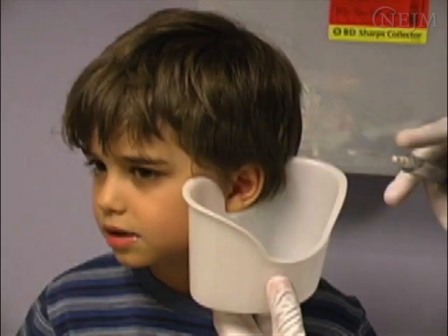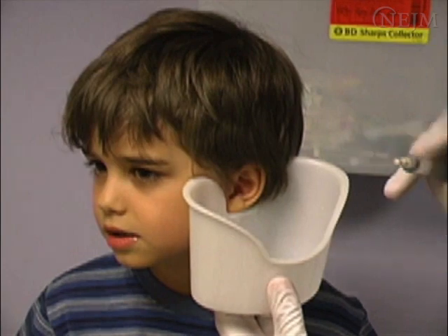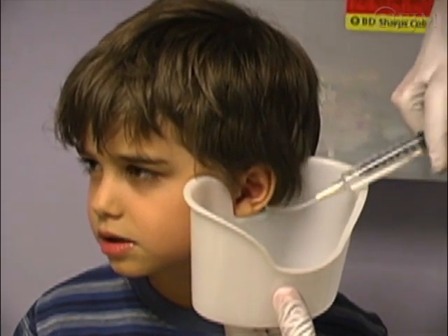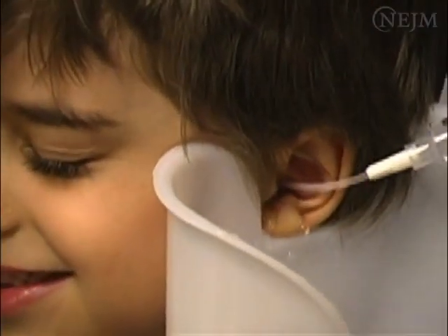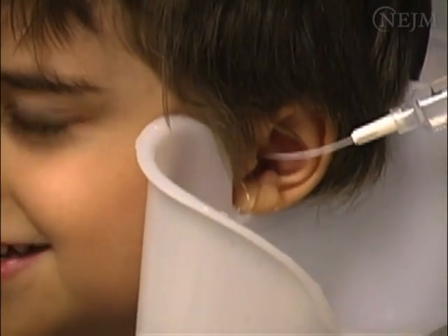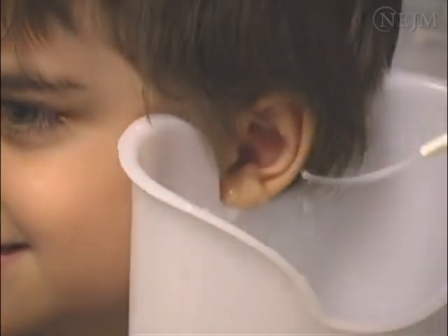Alternatively, you may use an irrigation technique. Obtain a large syringe filled with lukewarm water connected to butterfly tubing to flush out the cerumen. Use of cold water should be avoided, as it is uncomfortable and may cause nystagmus.